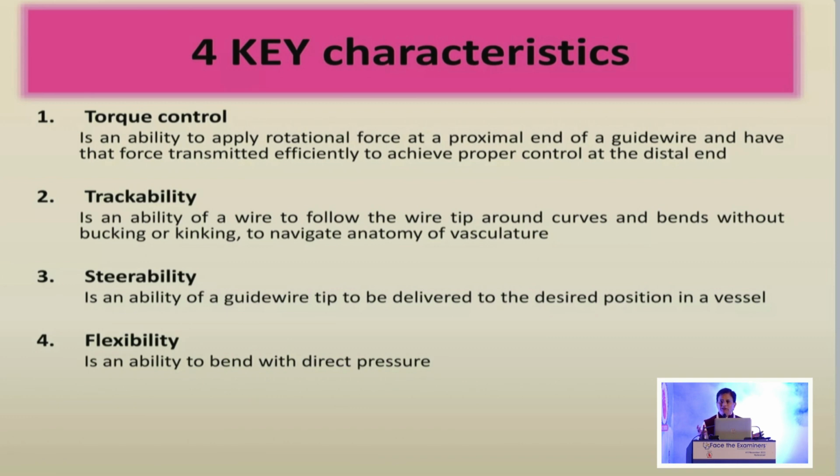Because what is the length of the guide wire? Any idea? I'm sorry? 175 to 180 centimeters. And what is the length of the long guide wire? Loud, please.